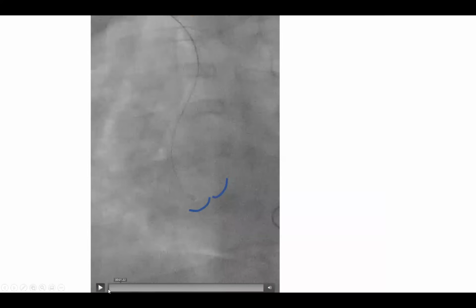Now, on that same patient, we decided to do PCI. So we got an Ikari left guide, and we tried to do the same thing. This was an Ikari left 3.5. I thought the aorta is too tight, so I didn't want to use Ikari left 4. So I got an Ikari left 3.5, and I tried to do the same technique, push it from the right cusp to engage. I couldn't here. It got stuck against the ridge of the right coronary sinus of Valsalva. So it's important to be versatile.